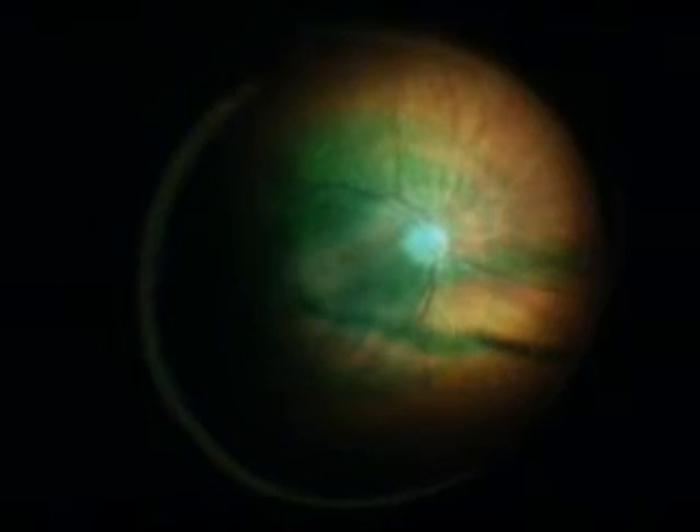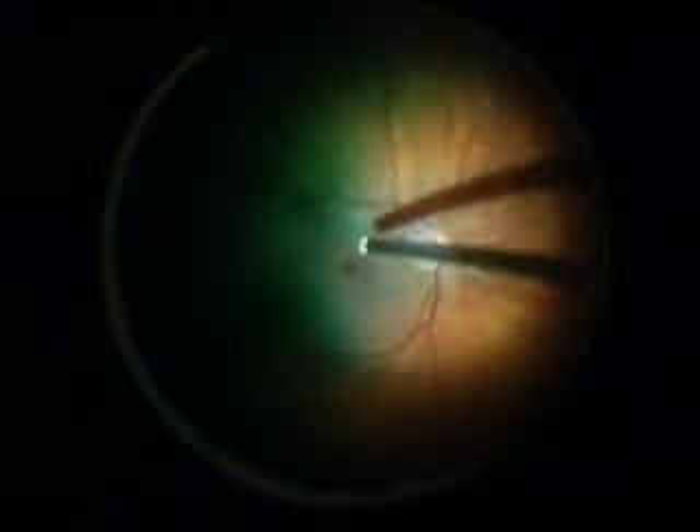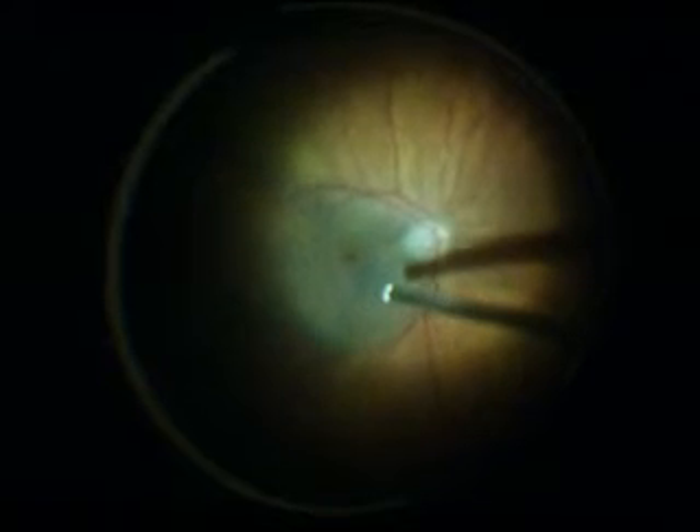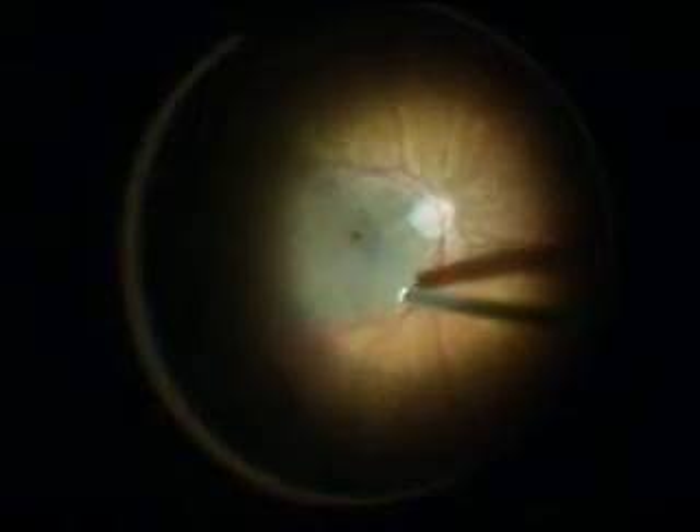We inject dye over the macula to stain its inner surface. The clear inner surface of the macula, called the internal limiting membrane, or ILM, is now easily identified by the green dye. This is gently peeled from the surface of the macula.